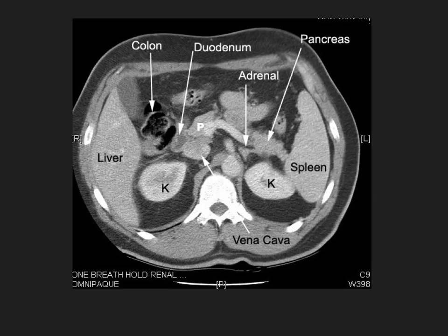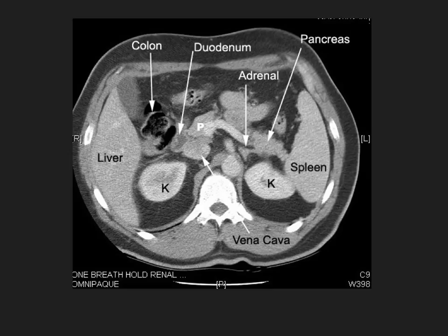Here's a normal CT scan of the abdomen — everything is labeled for your convenience. Going into this test, the highest yield organs to be able to pick out on abdominal CT would be liver, spleen, and kidney. Vena cava couldn't hurt as well, but liver, spleen, and kidney are really your big three. Sometimes pancreas, but again liver, spleen, kidney. Since we're looking up from the patient's feet, the liver is always on the right, spleen is always on the left, and kidneys are on either side.